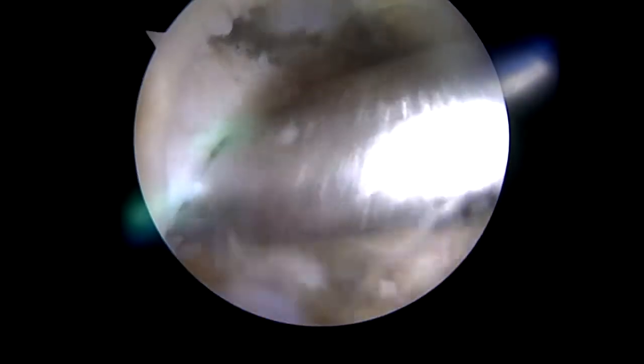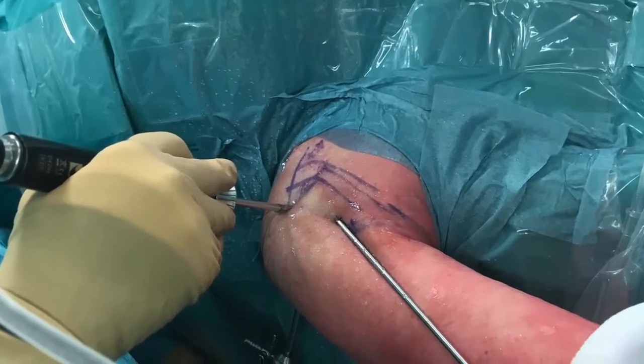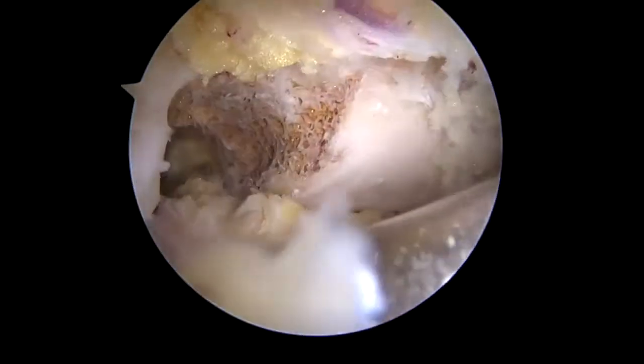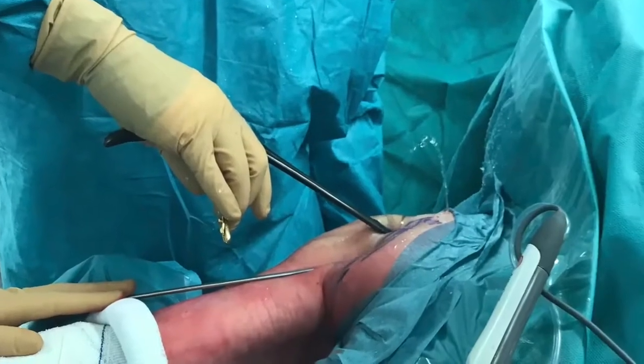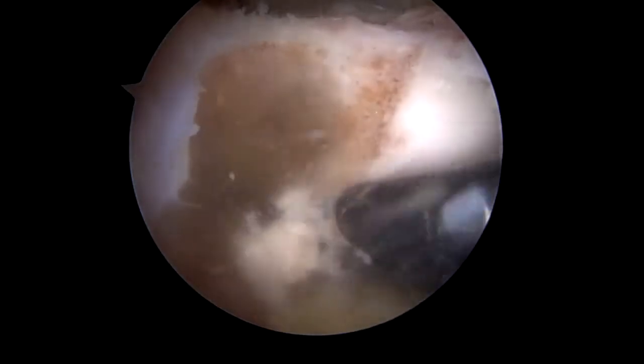The osteotomy is made at the base of the coracoid process. We advocate the use of a combination of the rasp and a motorized burr to perform the osteotomy. Here we finish the most medial aspect of the osteotomy with a Kerrison rongeur to reduce the risk of damaging medial neurovascular structures.